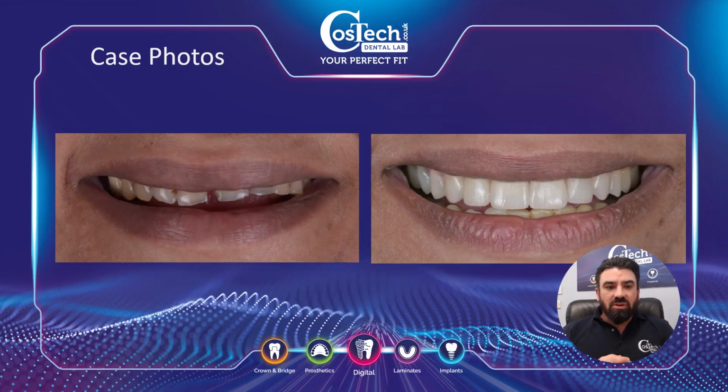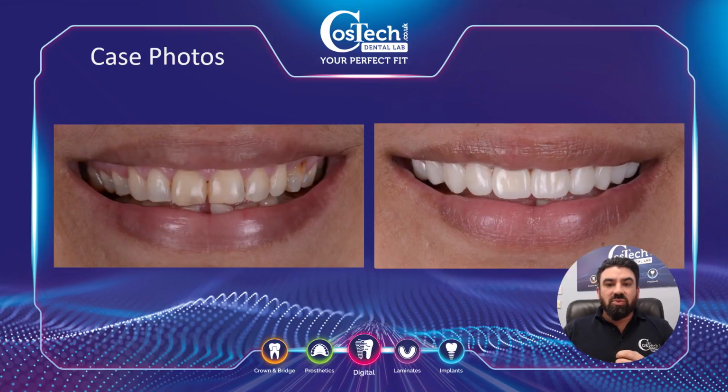Here's an example of where we went with veneers, again using exactly the same system. We were building up with minimal preps as much as we could, and finishing off with Emax. And this case was a direct bonding case, so the patient wasn't happy with the bleaching and just wanted the gaps filled.